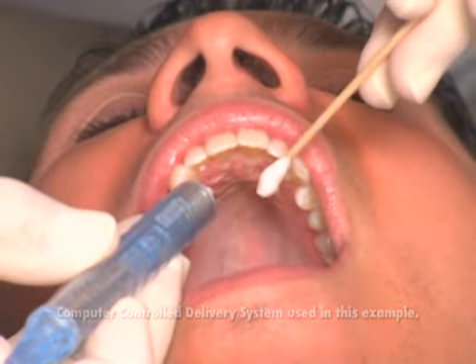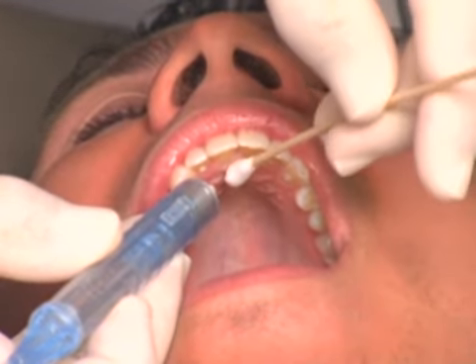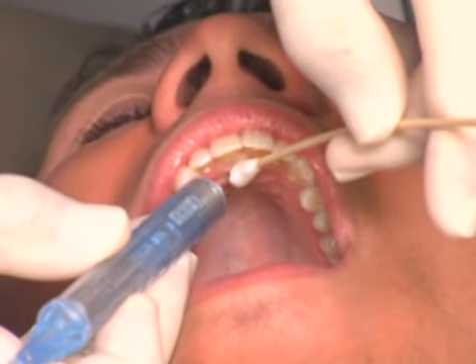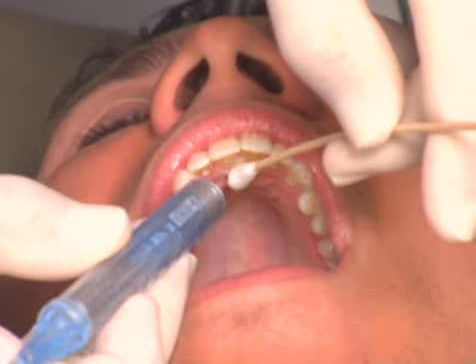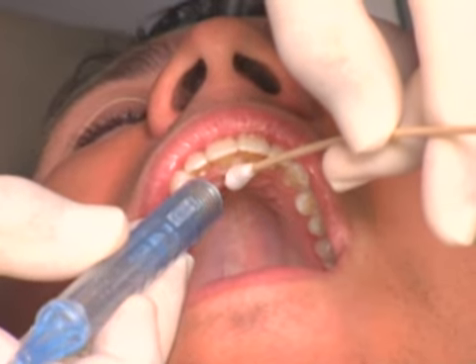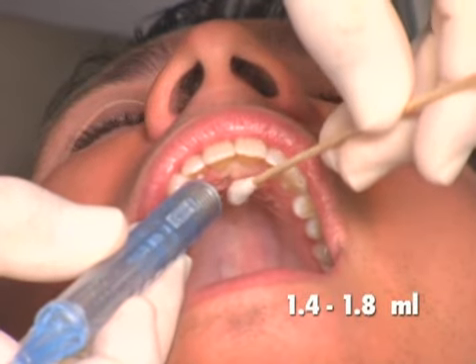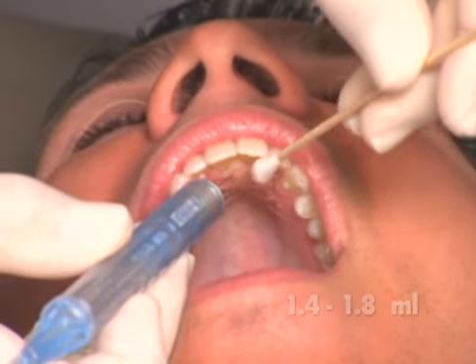The needle is inserted into tissue lateral to the incisive papilla. The needle is inserted slowly to a depth of 6 to 10 millimeters into the incisive canal. Following negative aspiration, a volume of 1.4 to 1.8 mL of local anesthetic is administered slowly.